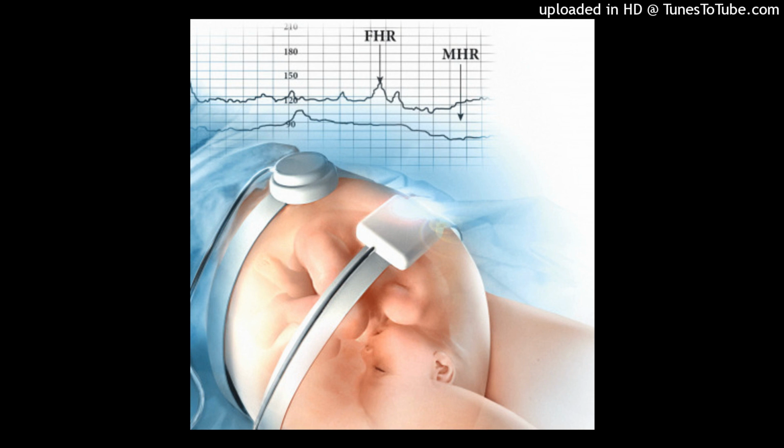In most facilities, the Doppler is selected to auscultate the FHR intermittently. There's a lack of evidence of which method of IA and intervals of counting are best for laboring women. One example of determining FHR baseline describes clinicians listening and counting for a set period, usually 15 to 60 seconds. Longer periods of counting may be required depending on the clinical situation.